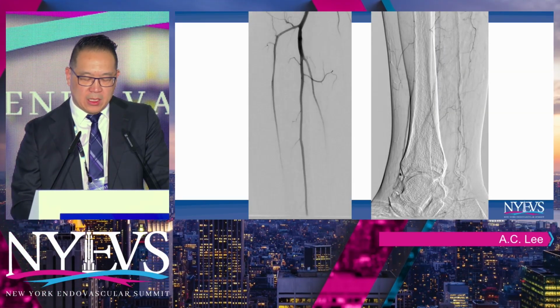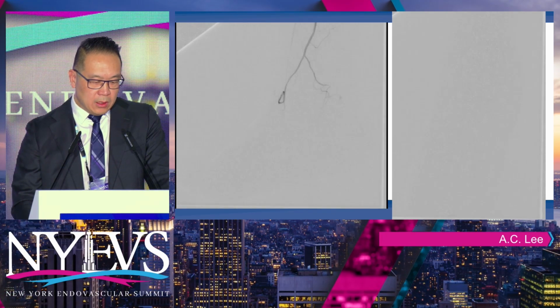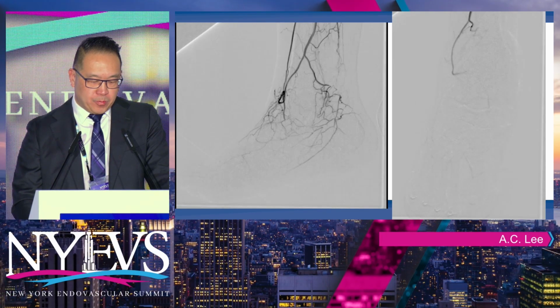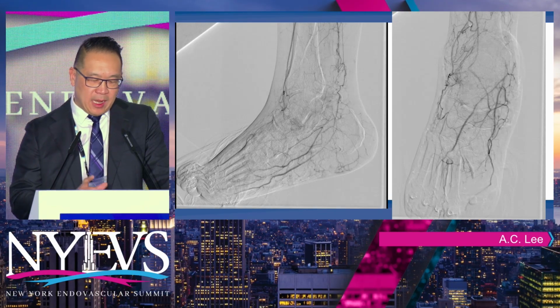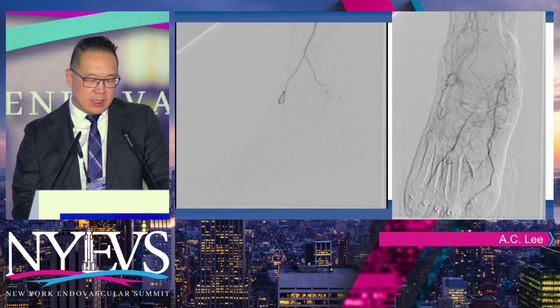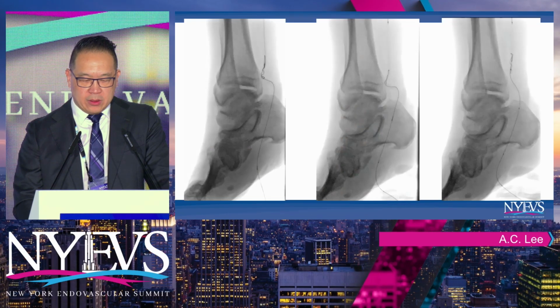You can see the calcium, the cast of calcium on the fluoro. Again, pedal disease. I think there might be an anomaly in the dorsalis pedis. It was a little hard to tell. But we got access in the arch of the foot.